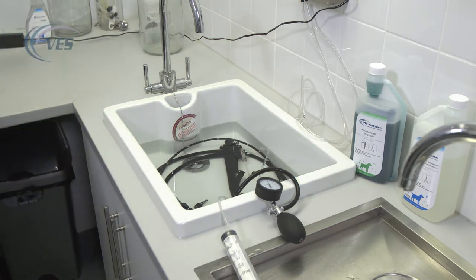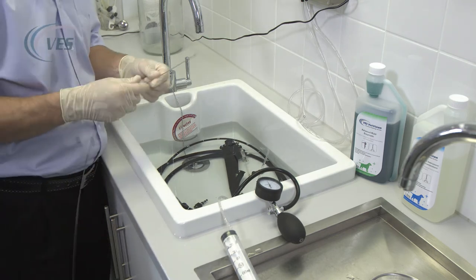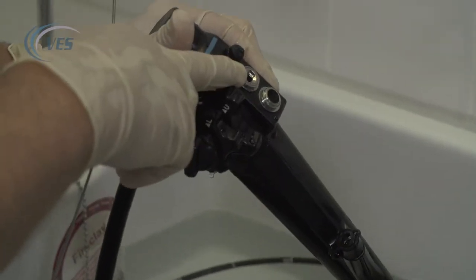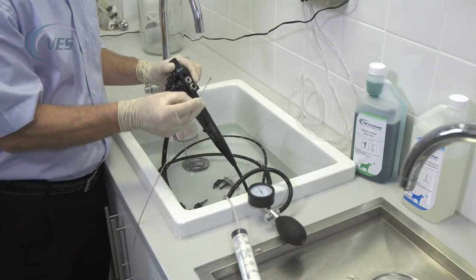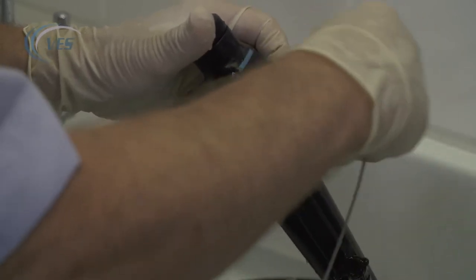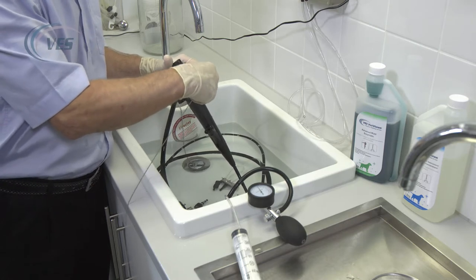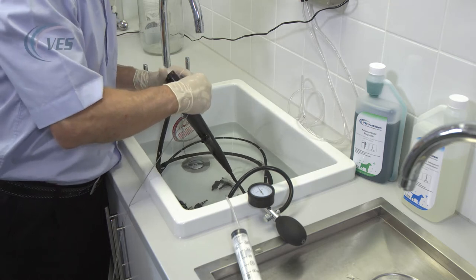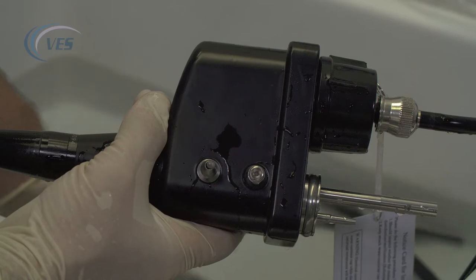The next thing we need to do is to actually brush through the channels in the scope. There are three channels that we're going to brush and these are located in the control body in the red port. There are two holes in the red port and we're going to brush through the biopsy port. We insert the brush using short sharp movements, as you would introduce biopsy forceps, and feed it all the way through the scope. The first hole that is straight ahead will actually come out of where your suction pump fits.